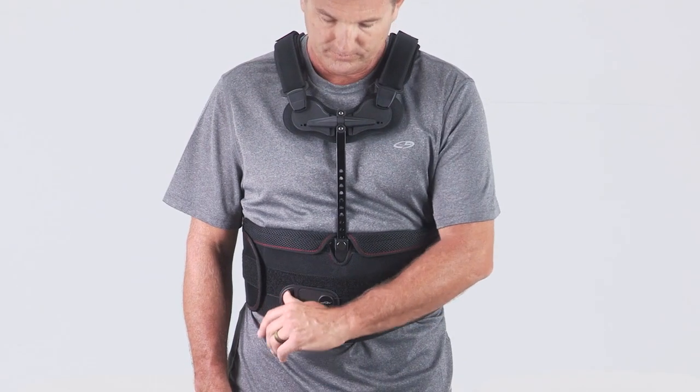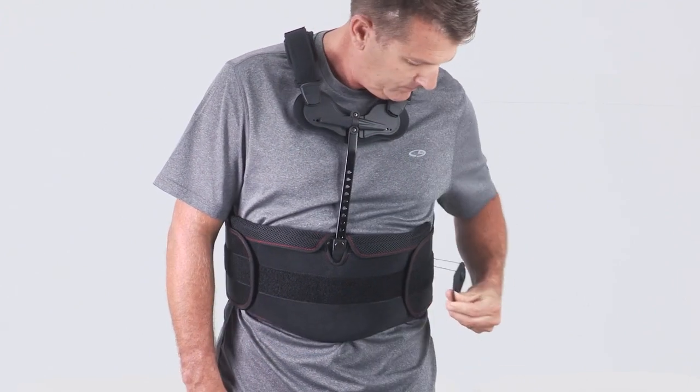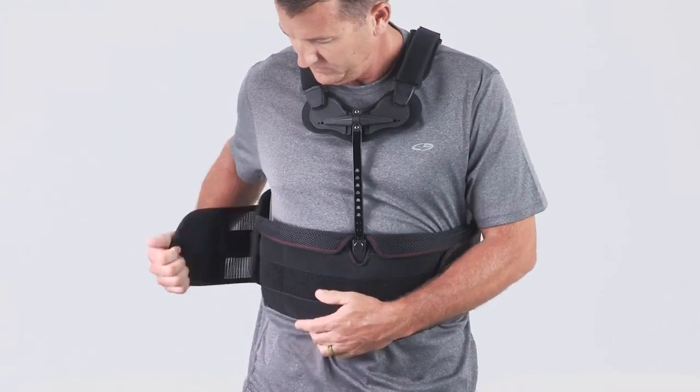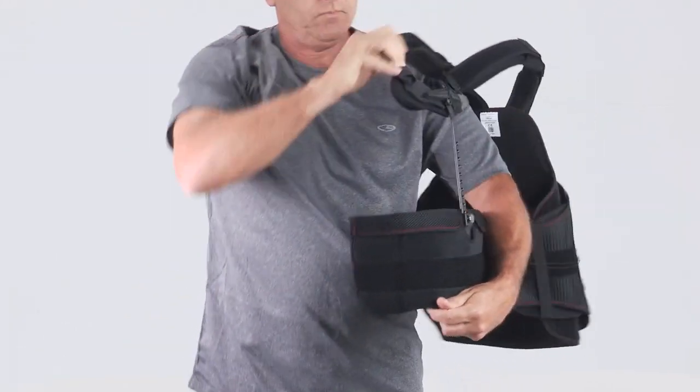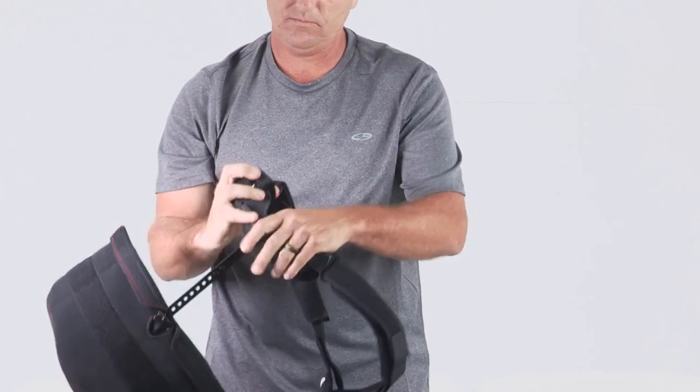To remove the brace, release the pull handle, open one of the side Velcro panels, and remove one of the shoulder straps. Slide the brace off the other shoulder like removing a jacket or backpack.